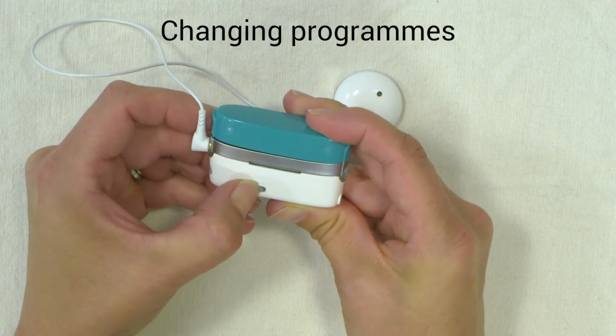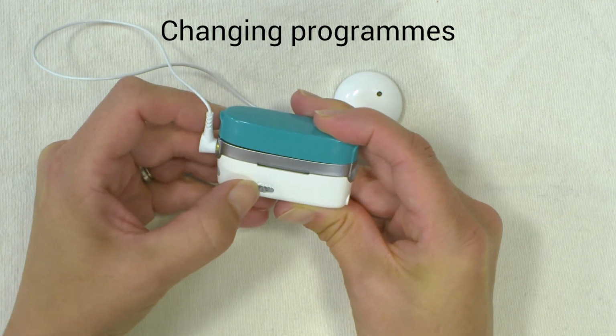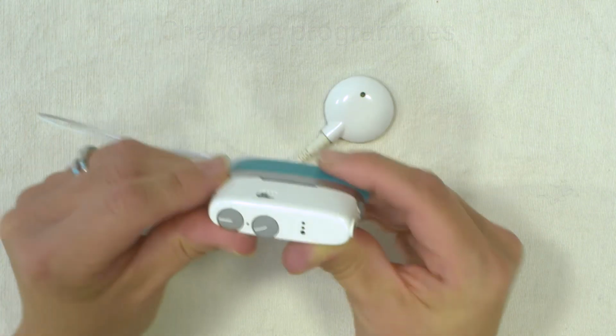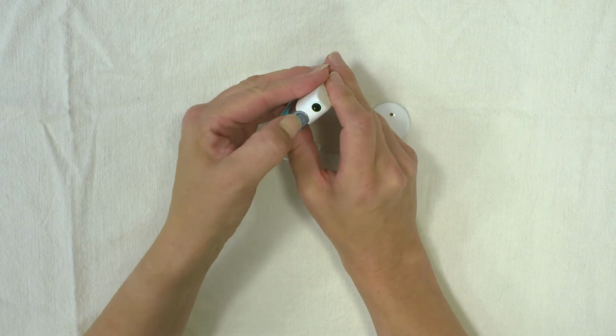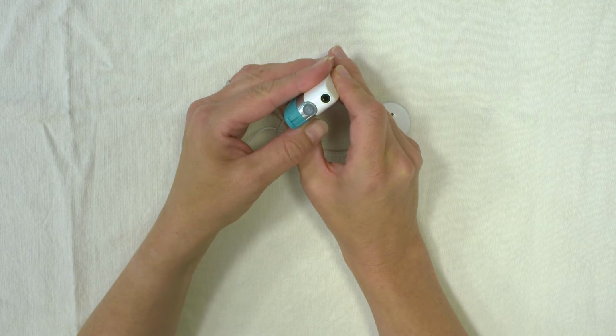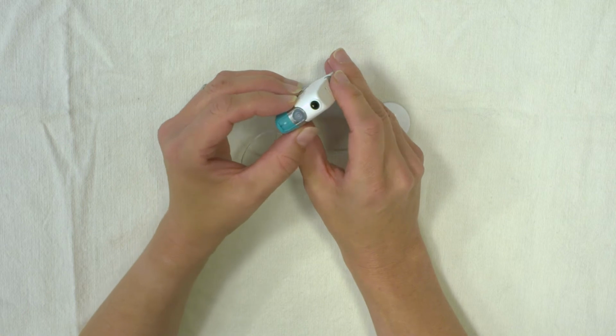So now if I put it to program 3, if you want to check that it's changed to program 3, you switch it on and count the number of green flashes, and that was 3 flashes. So we're on to program 3.